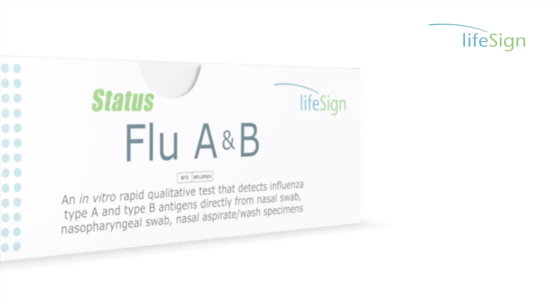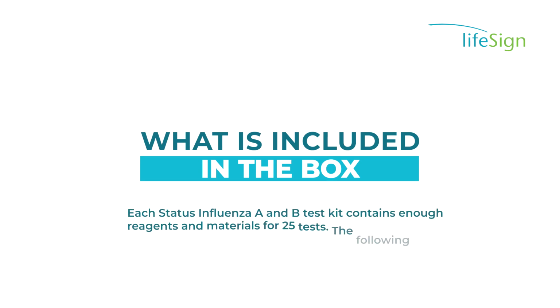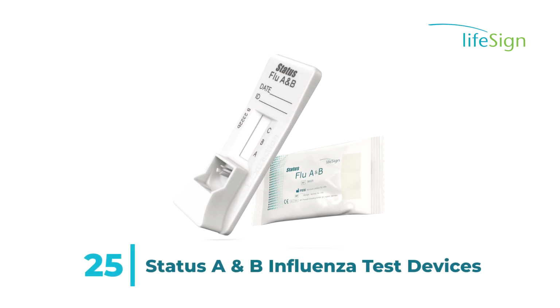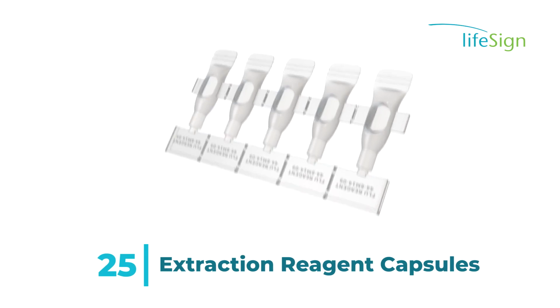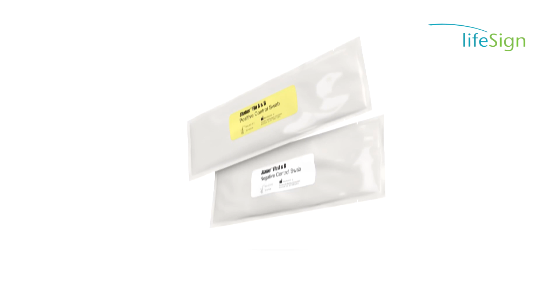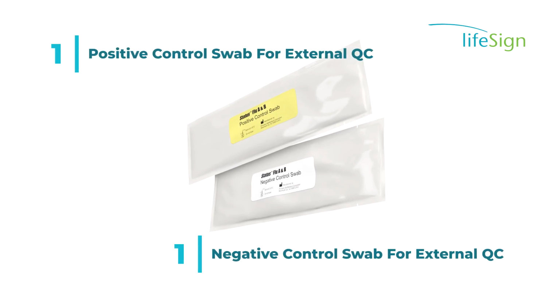Each Status influenza A and B test kit contains enough reagents and materials for 25 tests. The following components are included: 25 Status influenza A and B test devices, 25 extraction reagent capsules, 25 flocked specimen swabs, 1 positive control swab for external QC, 1 negative control swab for external QC, 1 package insert, 1 procedure card.